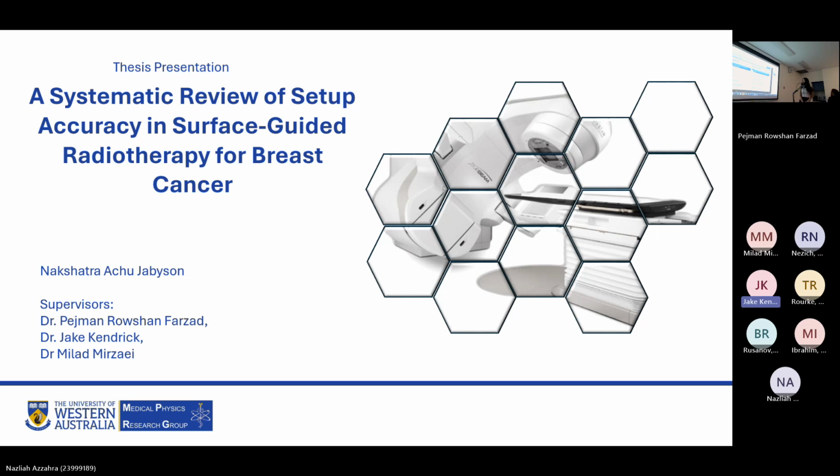The main focus of this presentation will be the setup error, which happens when the treatment position and the planned position change. In conventional practice, the main methods to tackle this problem are IGRT and tattoo-based alignment, and we'll get into that shortly. So first, there's IGRT.